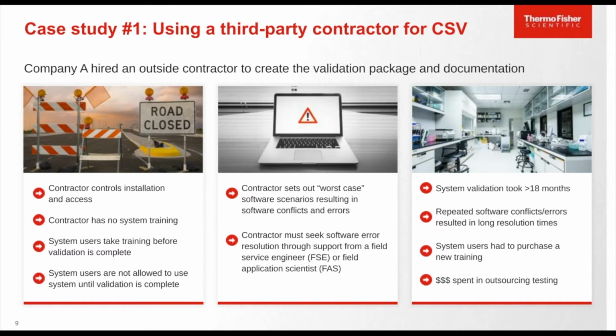In this situation, the customer chose to use a third-party contractor because they had multiple sites across North America where they were implementing the CSV at each of these sites. But in each of these cases, the contractor was in control of the installation and access to the MicroSEQ ID system. And the contractor didn't have any training on our system at all.